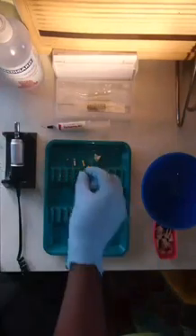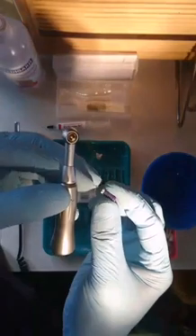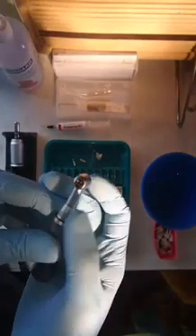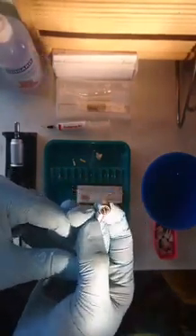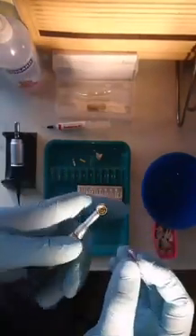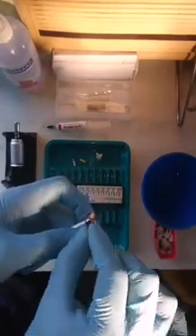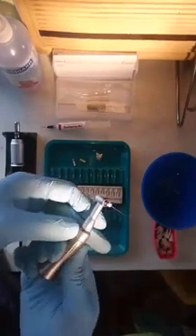So what I have here is a reciprocating handpiece where it mimics the exact action I showed — a watch winding motion. You can see this motion is mimicked using this handpiece. It has a push button: I press it and it opens up and closes. I take my size 10 file, place it in, and that is achieved.